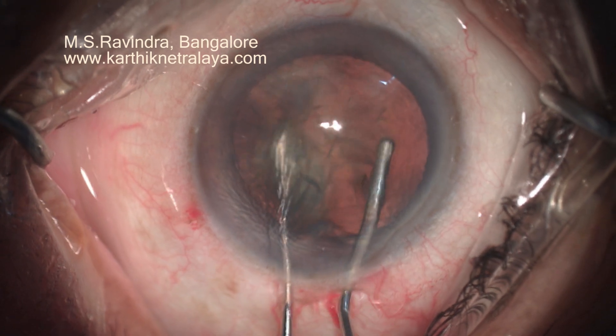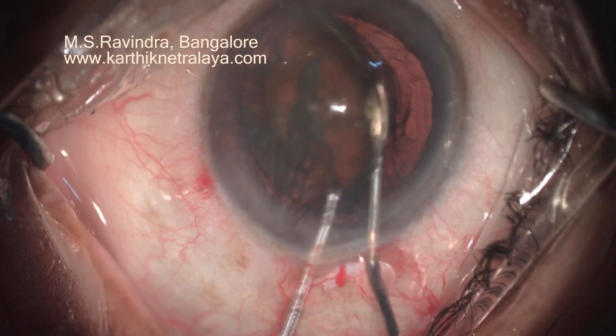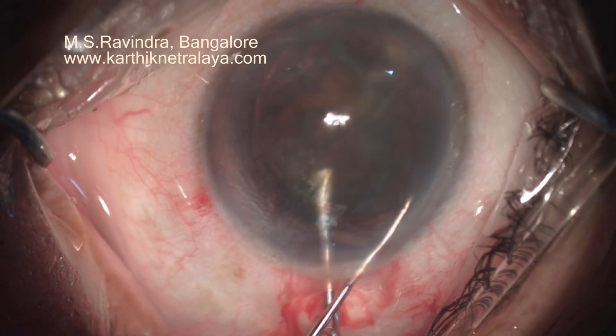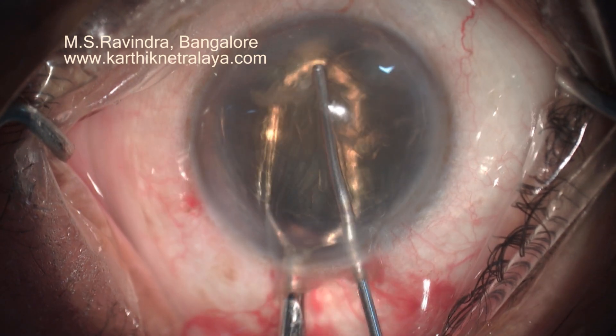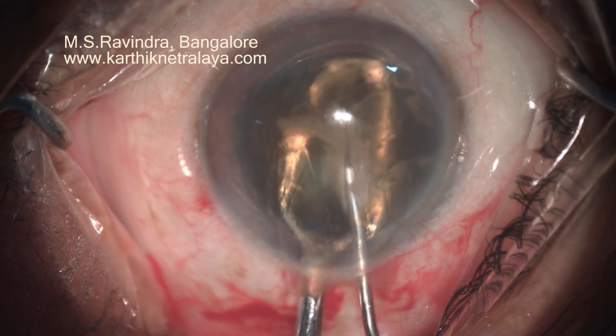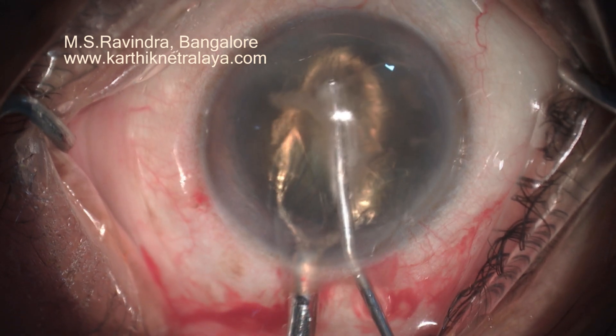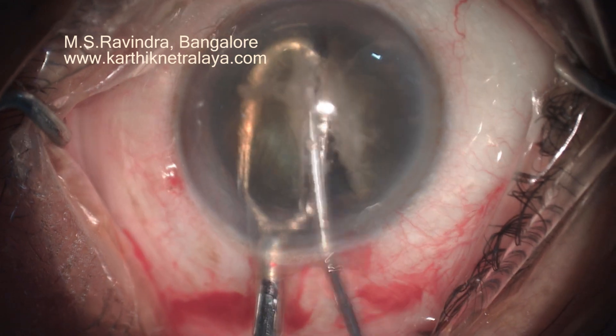Translimbal tunnel. Hydro-dissection separating the cortex and the capsule is done. The nucleus-epinucleus mass is rotated bimanually. The nucleus is prolapsed into the anterior chamber, supporting the nucleus-epinucleus mass with a mini-vectus.